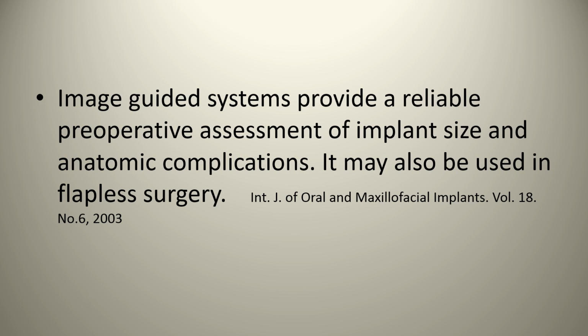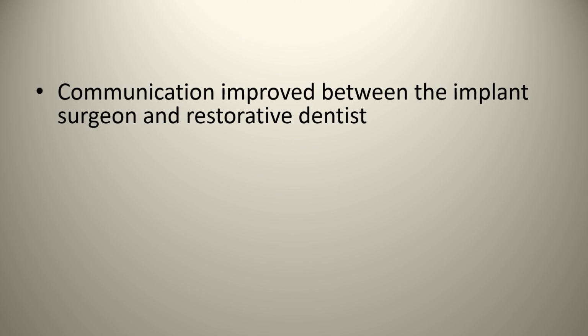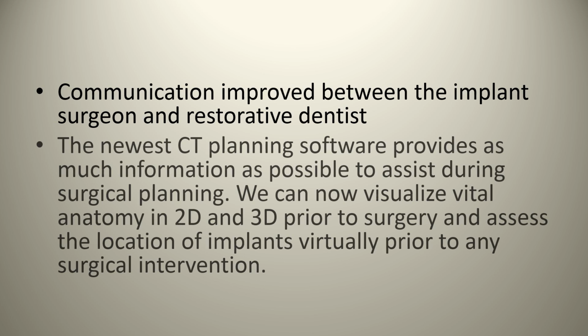So in 2003, image-guided systems were stated to provide a reliable preoperative assessment of implant size and anatomical complications, and could also be used in flapless surgery. Communication could be improved between the implant surgeon and the restorative dentist, assuming that they are not the same person. And the newest CT planning software provides as much information as possible to assist during surgical planning. We can now visualize vital anatomical structures in 2D and 3D prior to surgery and assess the location of implants virtually prior to any surgical intervention.